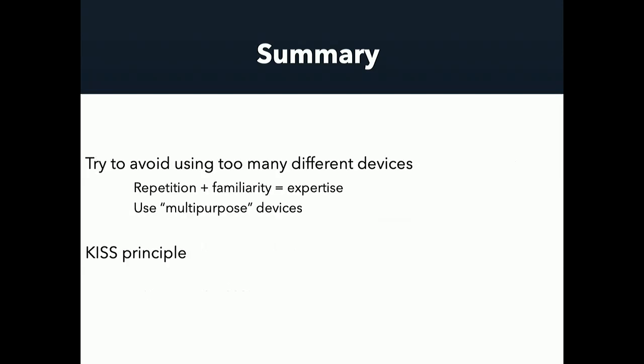Again, try to avoid using too many devices, and I think that's particularly apt for low volume centers, particularly if you're not doing many aneurysms. It's really important you stay familiar with a few devices and use multi-purpose devices wherever possible, and keep it simple wherever possible. And I think our colleague from Shanghai yesterday summed it up beautifully.